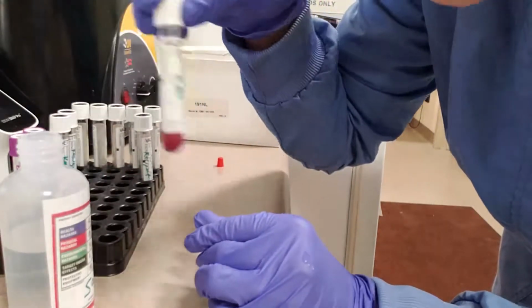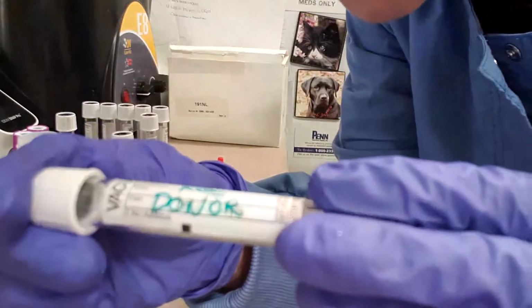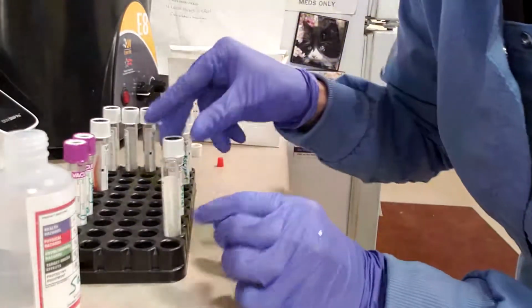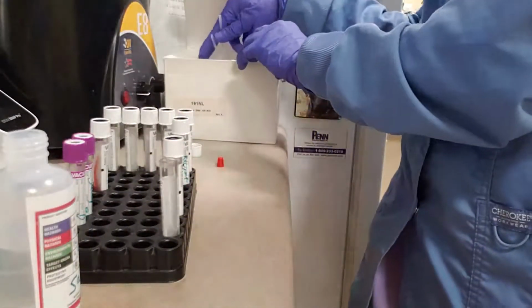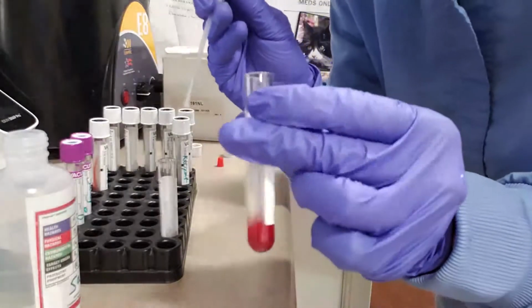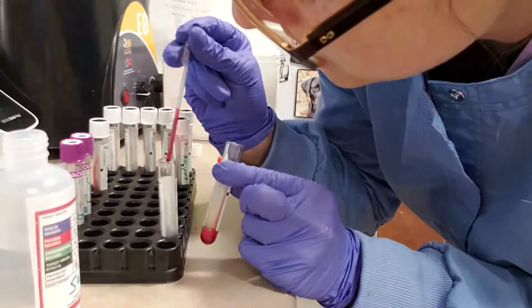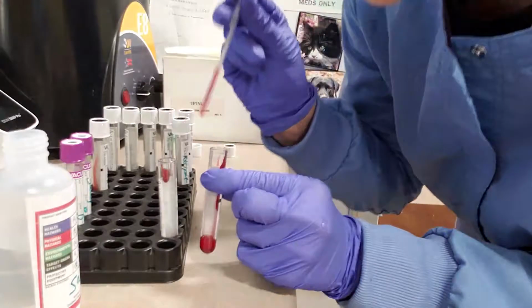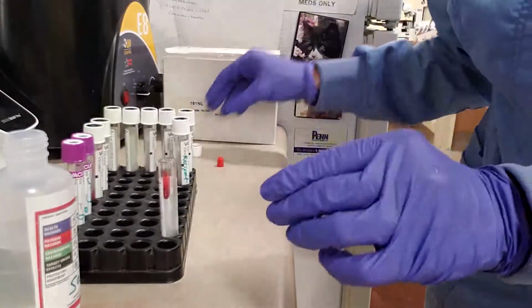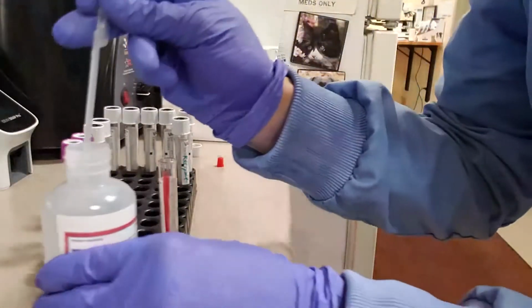Put that over here. So now we have our donor red blood cells, and we're going to do the same thing. We're going to take our resuspended red blood cell donor tube, and we'll put that right there. So a fresh pipette, and we're going to do 1 drop of our freshly washed red blood cells. So just 1. Discard our pipette. Put our red blood cells to the side. Again, with a new pipette, we're going to do our 20 drops of saline.